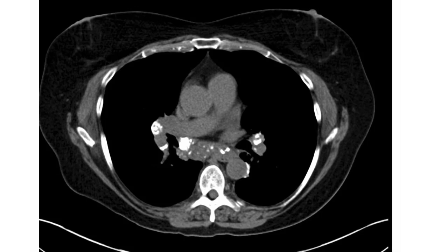This is a CT scan at the mediastinal level without IV contrast, and we see here multiple calcified mediastinal lymphadenopathy, some of which show eggshell calcification.